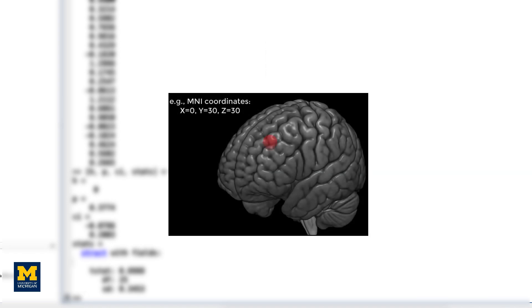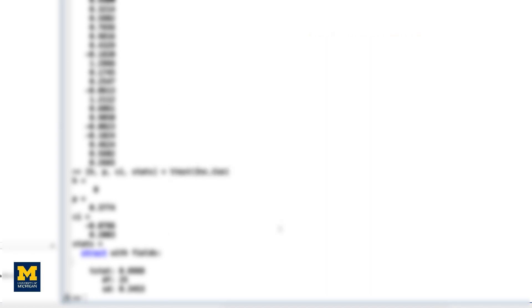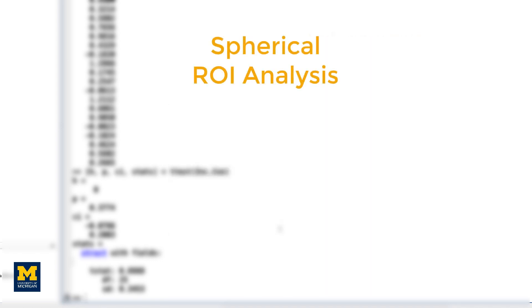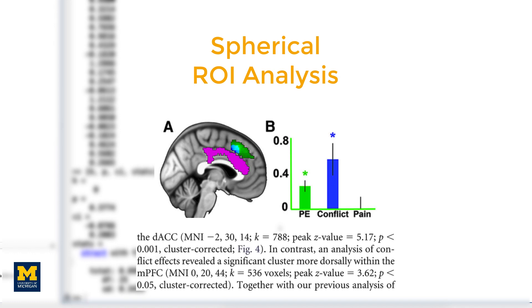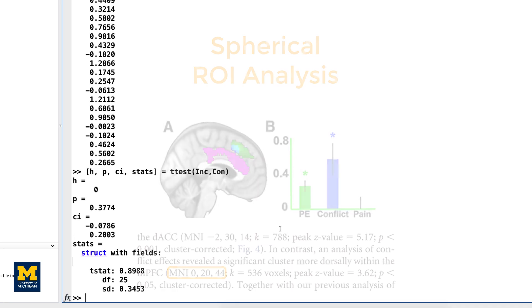Another technique is called the spherical ROI approach that we talked about earlier. This is considered an independent analysis since the ROI is defined based on a separate study. To create this ROI, we will need to use coordinates from another study. Let's randomly pick a paper, such as Jan et al. 2016. In the results section, we find that there is a conflict effect for a Stroop task — a distinct but related experimental design also intended to tap into cognitive control — with a peak t-statistic at MNI coordinates 0, 20, 44.